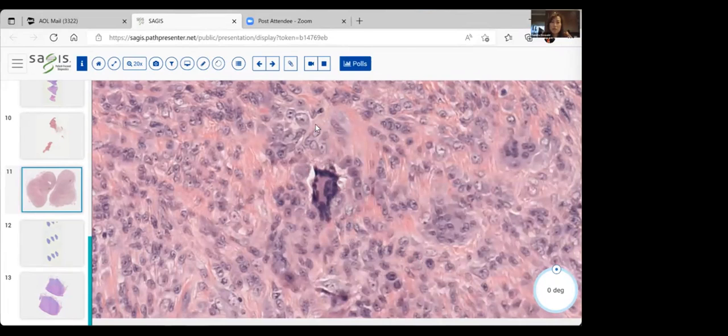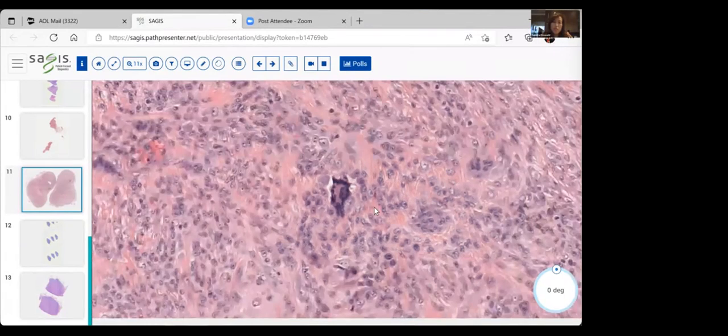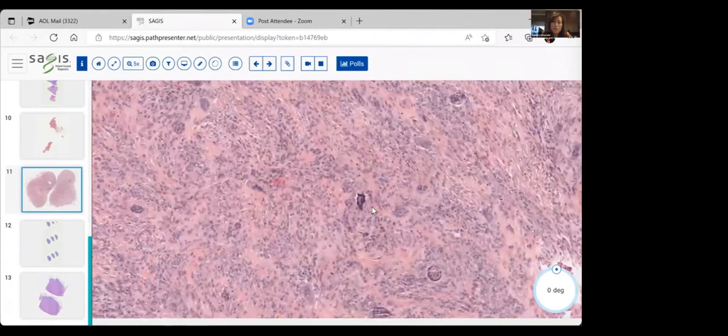When you see that in a mononuclear population, and these are kind of epithelioid appearing cells, then you might want to think of a giant cell tumor of tendon sheath. And that is what this entity is. These are CD68 positive. They don't know actually the etiology of these cells, whether it is fibrohistiocytic or whether this is actually related to osteoclast-like cells, but very, very characteristic. Usually look all very similar, look like this.